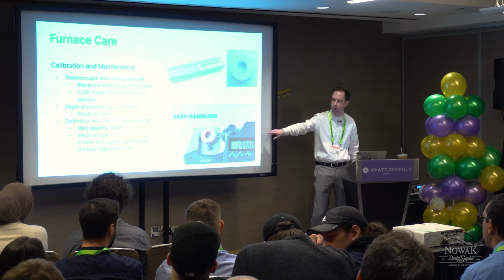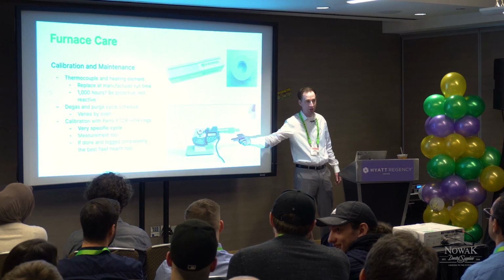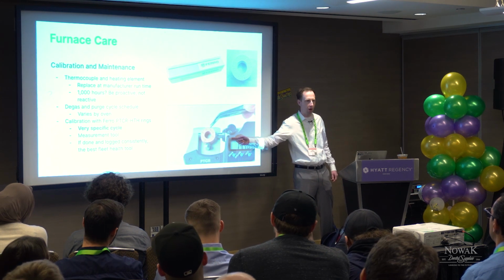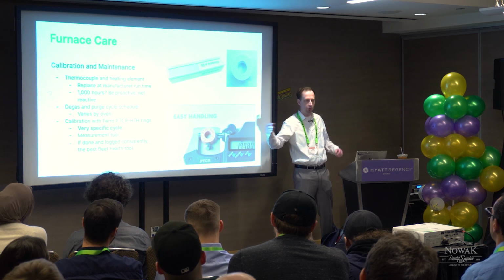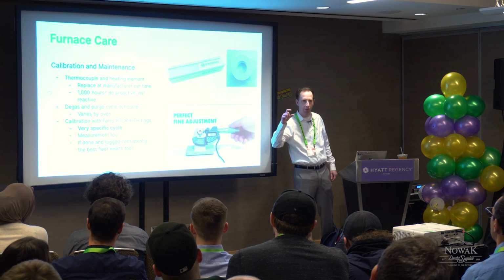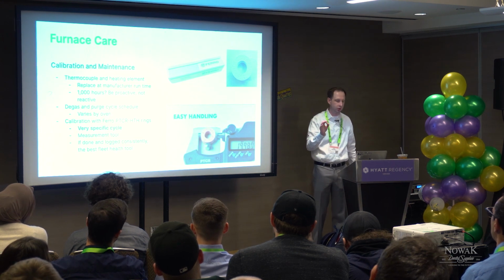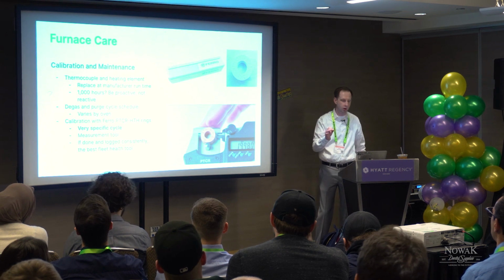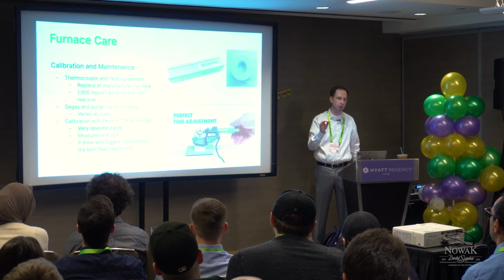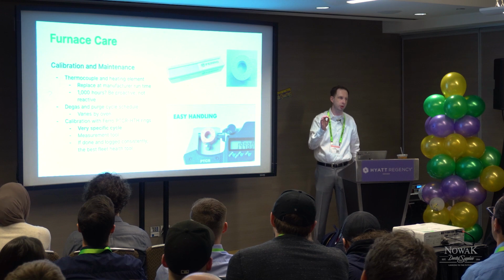calibrated and accurate. This is a really slick one that Ferro actually recommends on their website, where it has this nice holder. You don't want to be doing this by hand. It's expensive, but it's well worth it. The proper alignment, being able to take measurements from a couple different rotations and averaging those numbers out, using the right sintering cycle for the ring will give a super accurate temperature reading. So when it thinks it's going to 1500, it will tell you actually what it's going to.